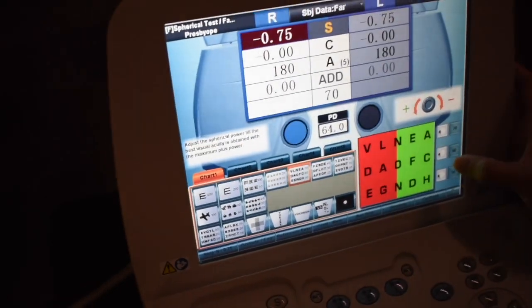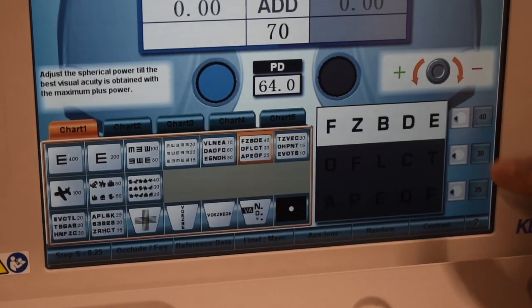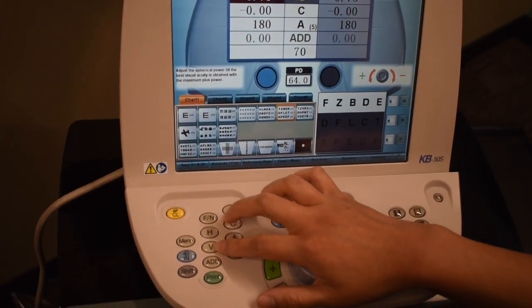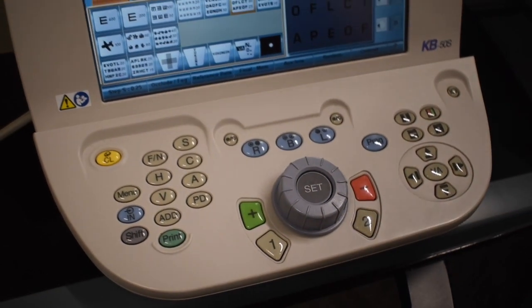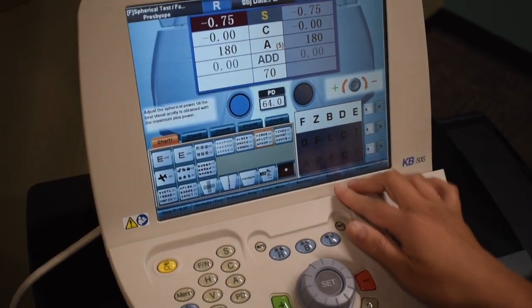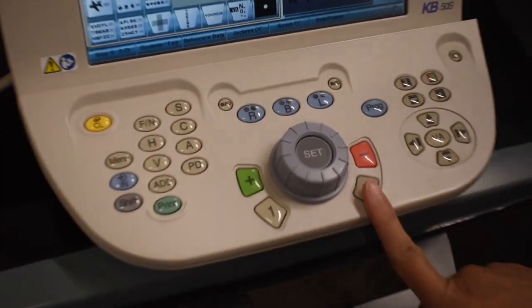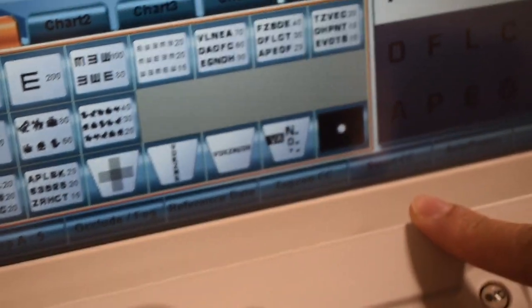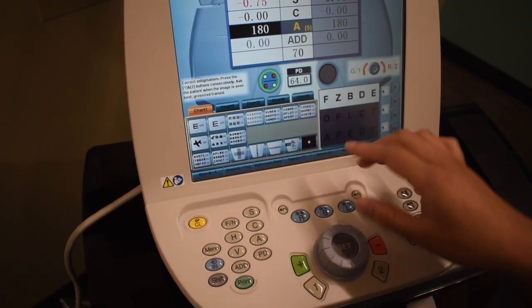Now I'm going to be putting up the 2040 line — you just hit this button here and it should be back to the black and white screen. Isolate the 2040 line. To bring up the present on the top line, you're going to hit either the H or the V, standing for horizontal and vertical. To do the JCC, you're actually going to hit either one or two here, and it'll bring up this screen where you hit Jackson CC.